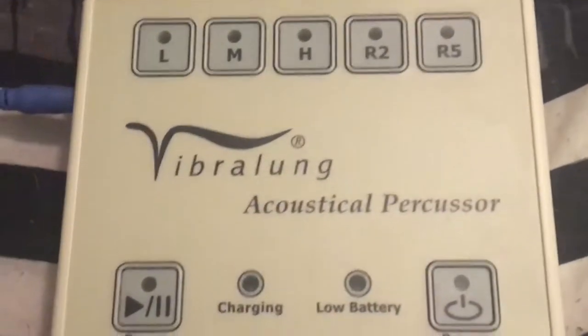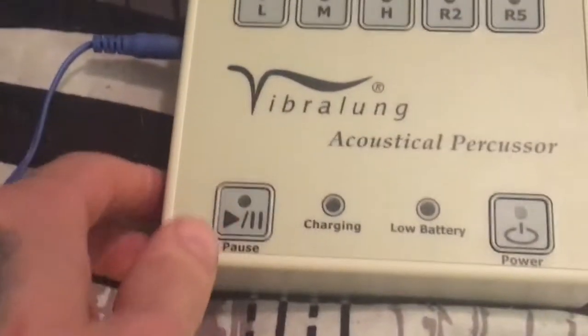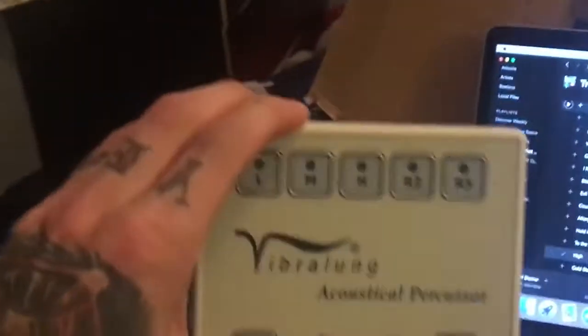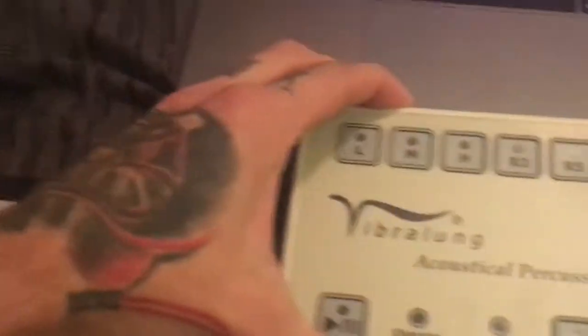It kind of sounds like you're playing a game of Dig Dug. It is hilarious, it is annoying, and I'm here to show you how it works. So this is your main piece to the Vibrilung — the whole power source, how it all works. Just this tiny little thing here.